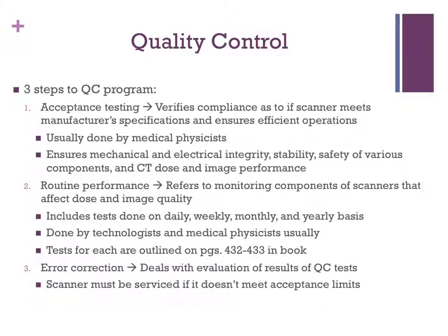The next step is error correction, which deals with the evaluation of the results of the QC test. If the scanner doesn't meet the acceptance limits established for a particular test, then the scanner must be serviced to ensure that the acceptance limits do get met, so the errors are corrected.